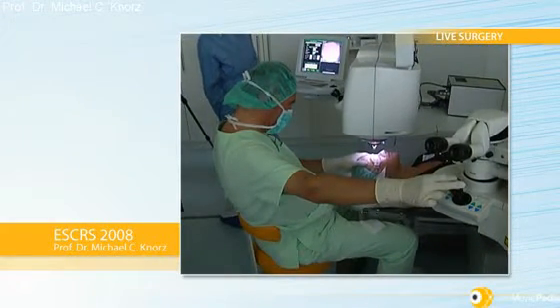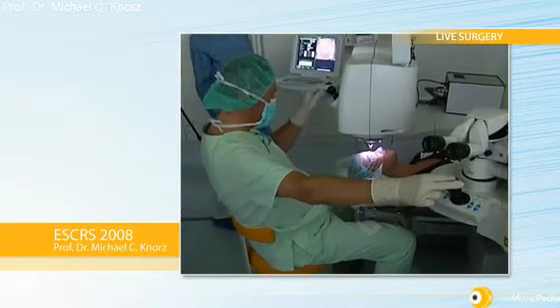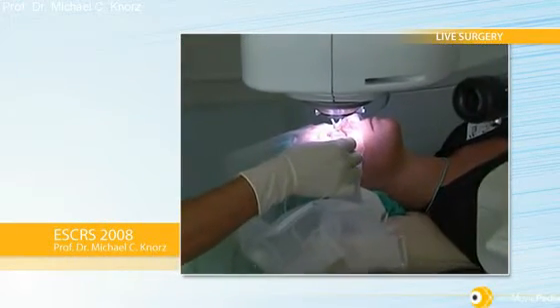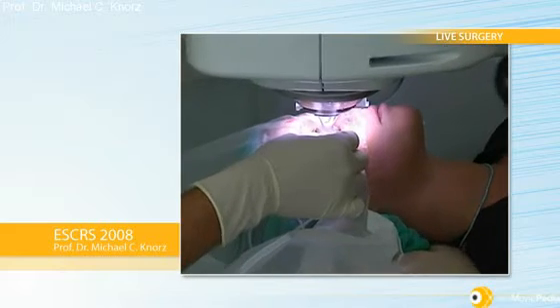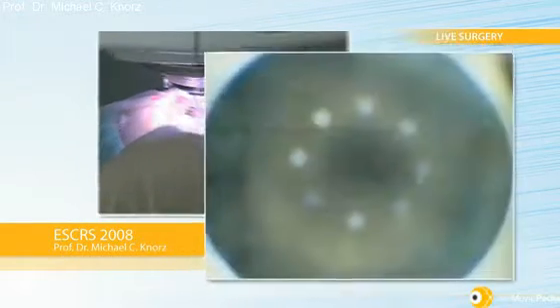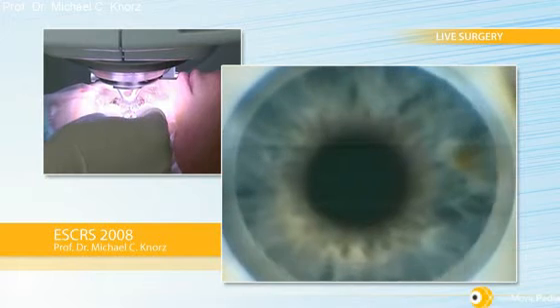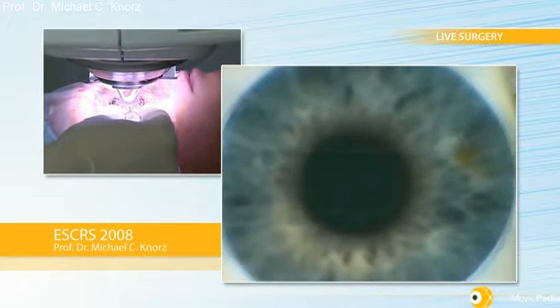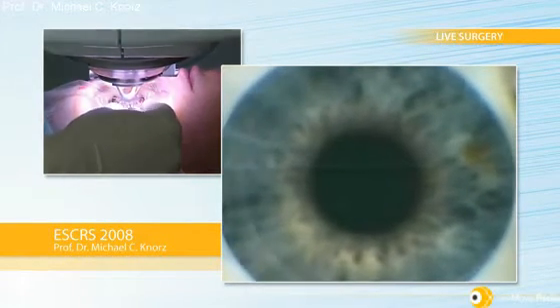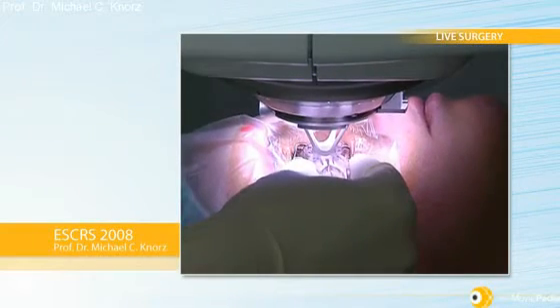Now I tilt the eye slightly away, bring the head slightly away from the eye, bring up the patient's bed, and then dock. Once I'm centered to the suction ring and I hear the beep, I will open the suction ring and let the applanation cone come down on the cornea and make sure I get a little bit of a meniscus, especially at the 12 o'clock position.